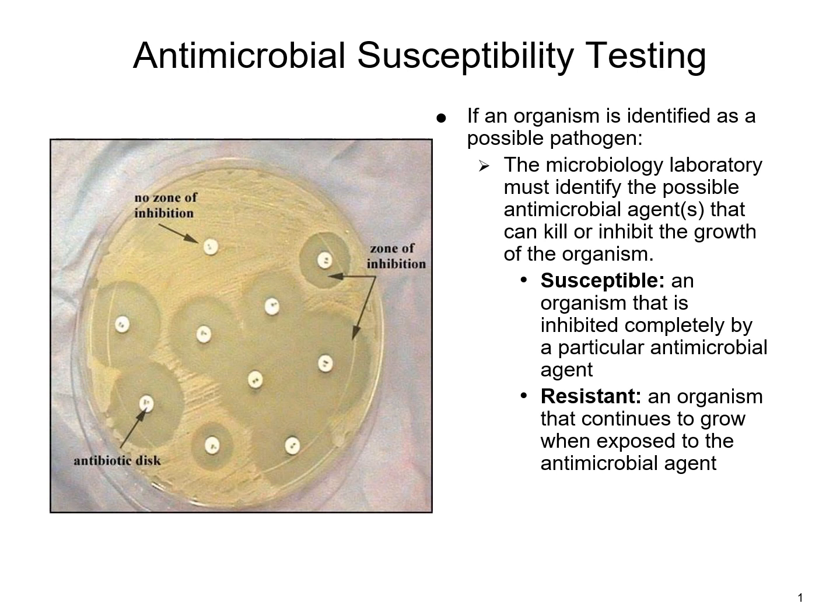Now let's figure out which antibiotic is going to work, because over time certain bacteria, because of their cell wall makeup or other factors that are involved, can become resistant, or the antibiotic is just not able to kill that particular organism.